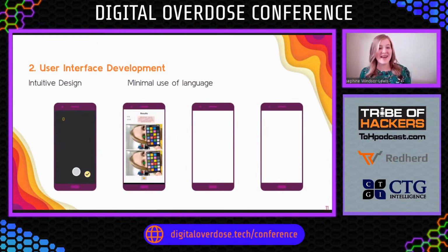What you want to do is zoom and pan those images to create a sample. Now, it's quite difficult to fill an entire camera screen with just the white of the eye of a baby. That's a really small area. Usually you get some face, you get some eyelid, you get some hair. So what we needed to do was create a sample of that image because we just want to look at the color of the white of the eye.